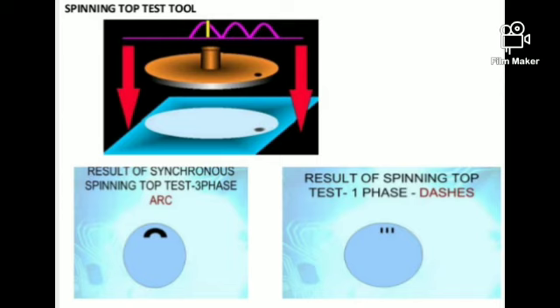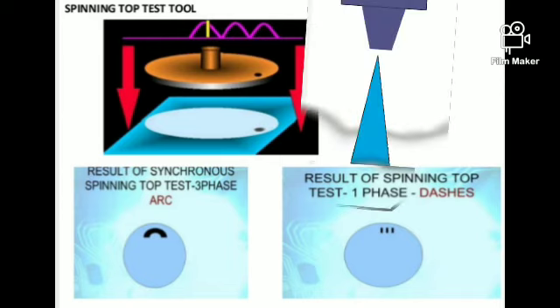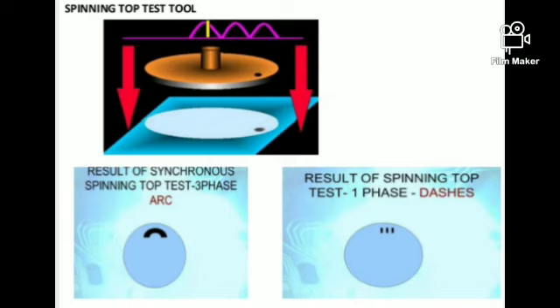You can see here the spinning top device which we use mainly for the timer check. Next, moving straight to the procedure. First, we adjust the height to 100 cm SID. Next, adjust the KVP within the range of 60 to 70 and the mAs of 40 to 80. You can do the test for two settings, one for an applied time of 0.4 second, another for 0.8 second.